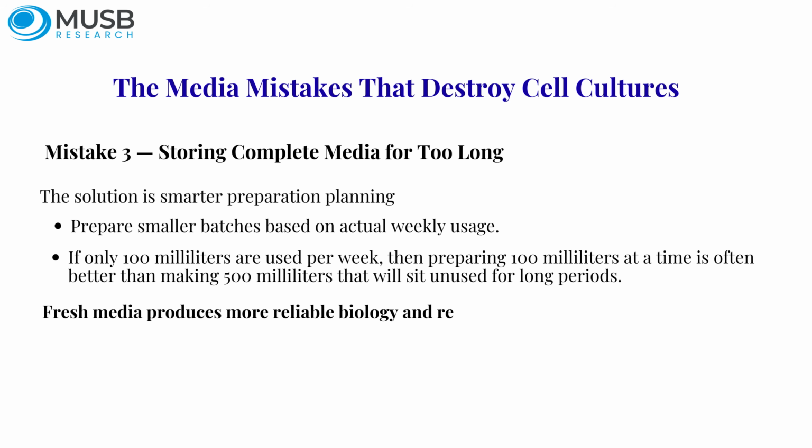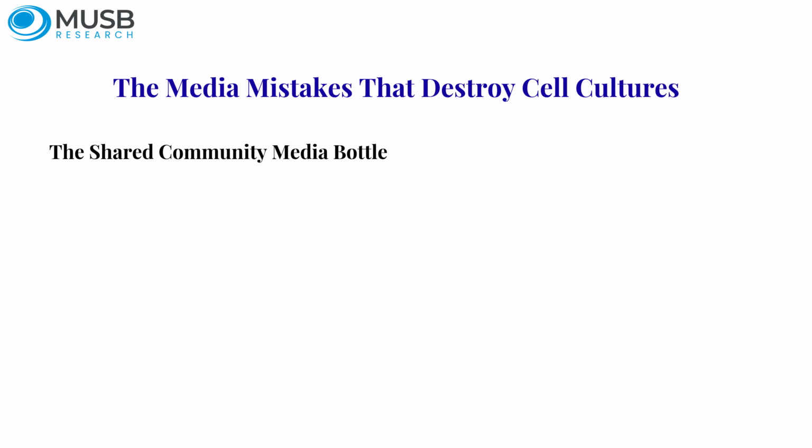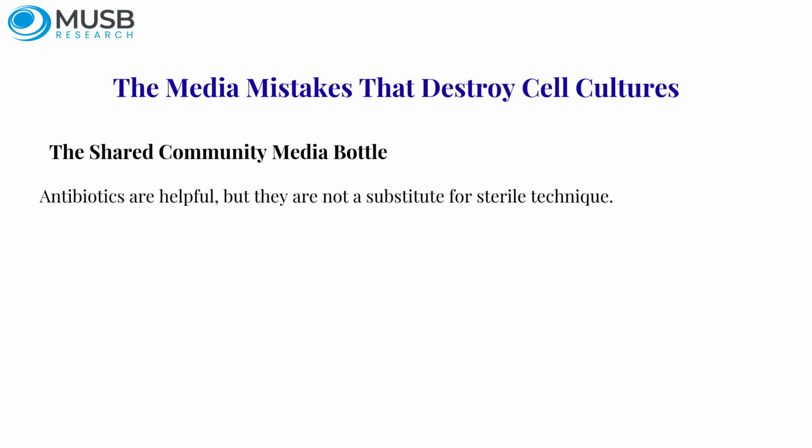Fresh media produces more reliable biology, and reliable biology produces reliable science. Mistake 4. Over-reliance on antibiotics. This is one of the most dangerous habits beginners develop. Antibiotics are helpful, but they are not a substitute for sterile technique.